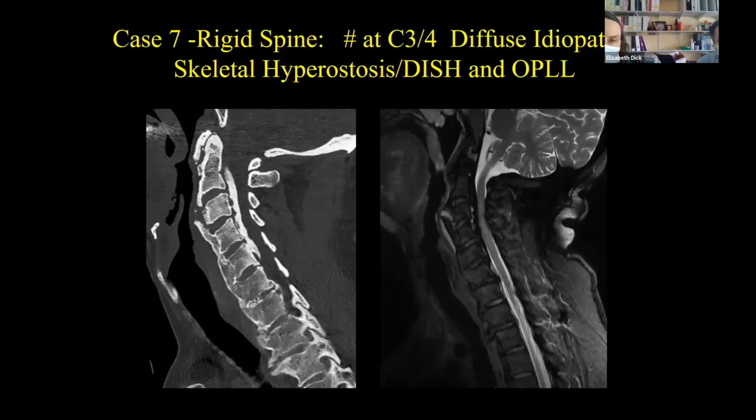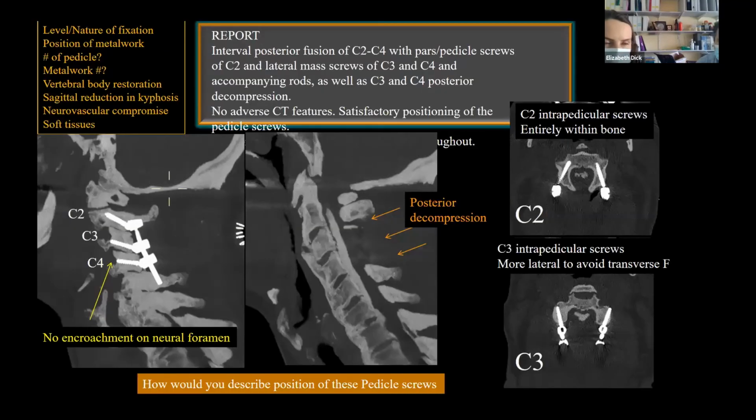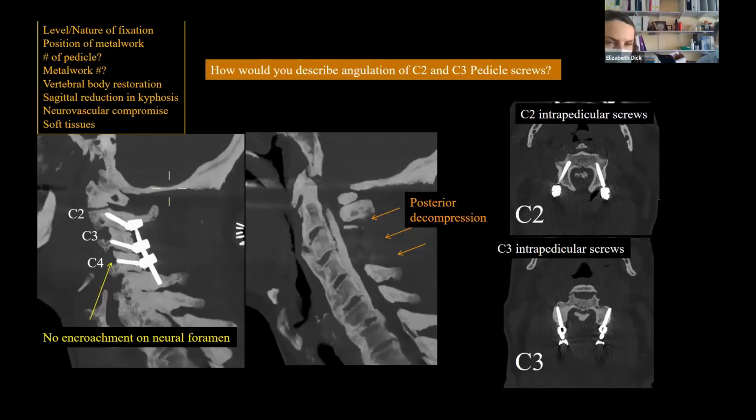Okay, moving on. So this is a patient who has a rigid spine. Actually, it's quite interesting, as Reza pointed out to me. He's not only got DISH, diffuse idiopathic skeletal hyperostosis, but he's also got OPLL, so ossification of the posterior longitudinal ligament that we see here. And obviously he's got central cord contusion. So, I would say as a complete amateur that this looks like it might be quite a hard thing to fix. But I put these images up to show what the optimal position of lateral mass screws could be.